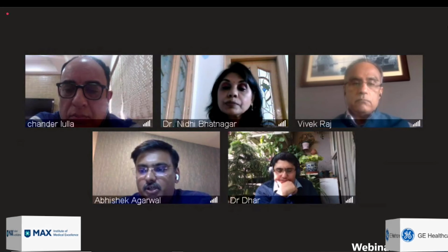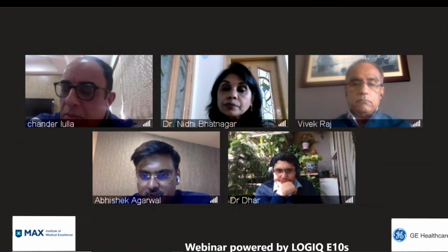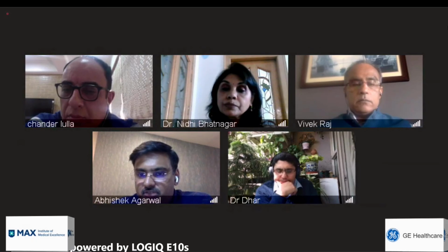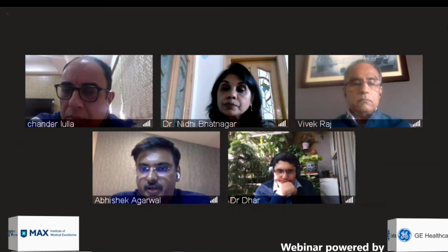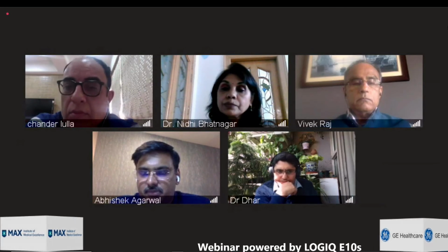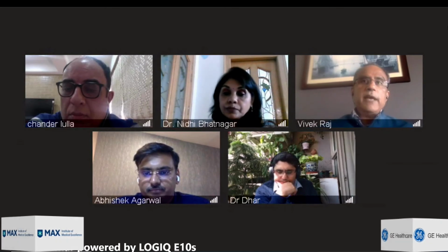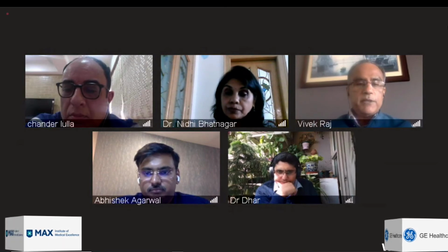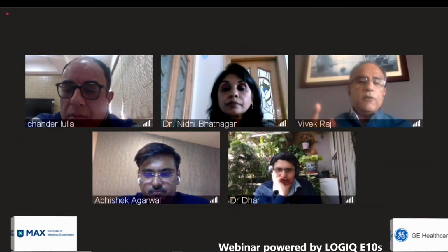Right. So in viral hepatitis, you think elastography is a good mode for surveillance? And how frequently should it be done, and how do these values mean to you when they come as follow-up? I mean, do you believe in absolute values, or do you believe in relative regression or progression of values in each patient? How do you interpret the elastogram as a follow-up? So for me, the absolute numbers are not number one, because many times they get it done from different people, different sources, different machines. So the value itself as an isolated number doesn't help me as much. What helps me is the trend.